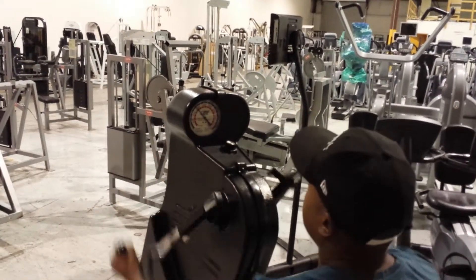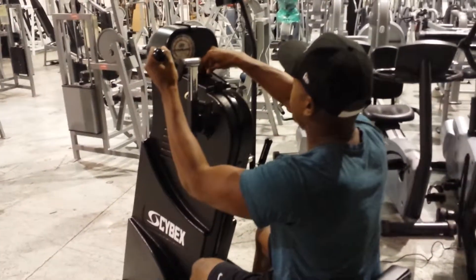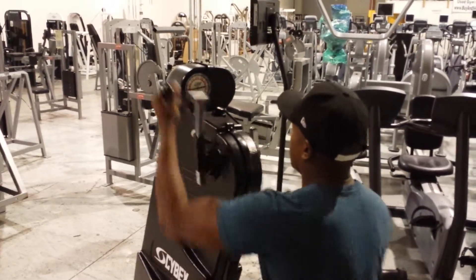It measures the pressure and revolutions per minute. If you want it easier — much easier — you can dial it back.